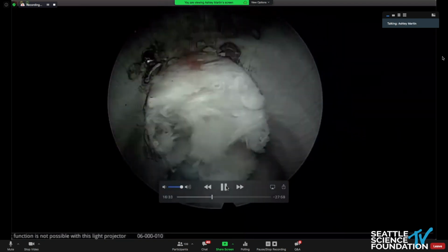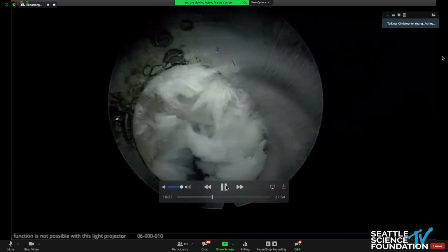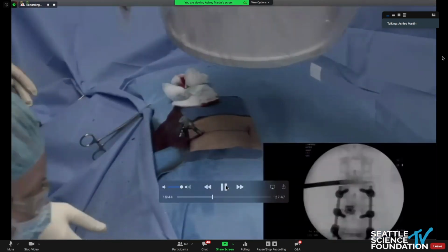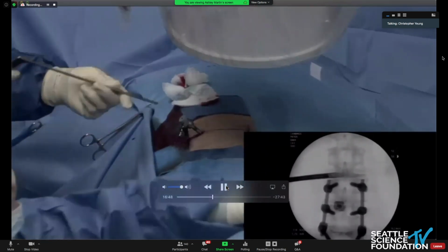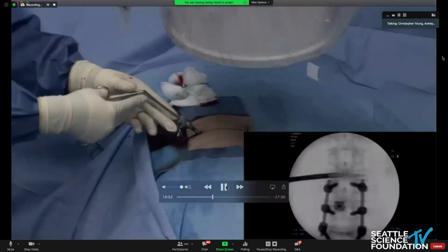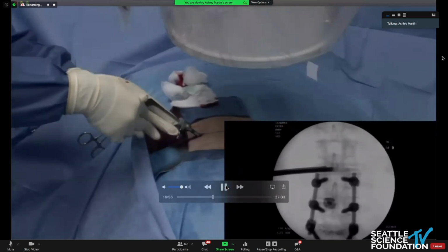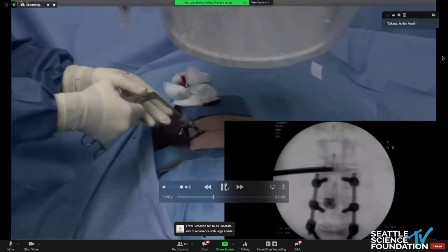If you take out the endoscope, then you can use larger pituitary rongeurs, which are called short fat pituitary. So I'm going to position this cannula in the epidural space, and you do this under fluoroscopic guidance, after the cannula is positioned safely right at the edge of the annulotomy. Yes, I'm right at the entry zone. And just kind of grab with these bigger instruments.